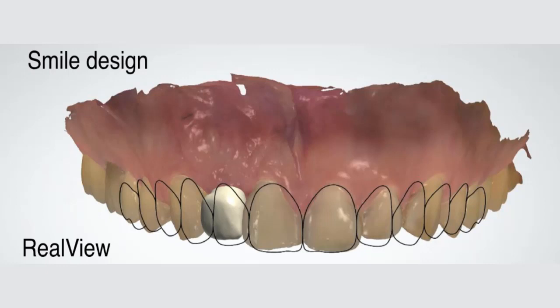Then it's just you doing a training to make sure that things will be at least similar or close to what you are proposing. And then the third step would be the case execution. It's you doing the case. Those are the 3 components that you should keep in mind. Very fast processes and procedures, as long as you speed up your knowledge and understanding of computers.